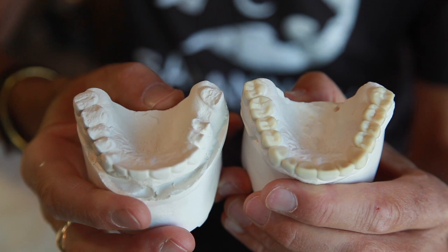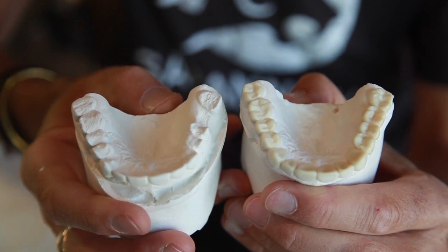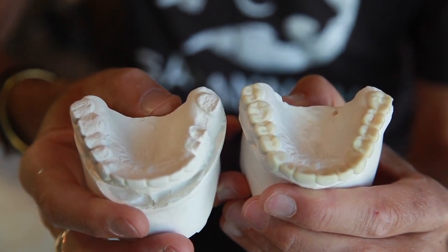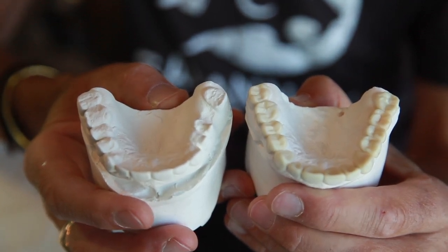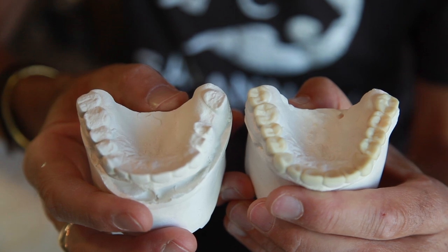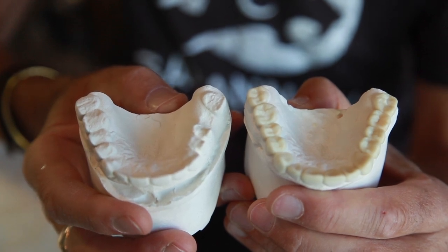This is exactly what we do. This is the knowledge we have here in the laboratory. I think it's what sets us apart from a lot of laboratories — that we understand tooth form and how to get people's systems back in harmony.